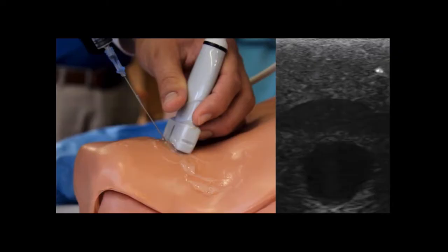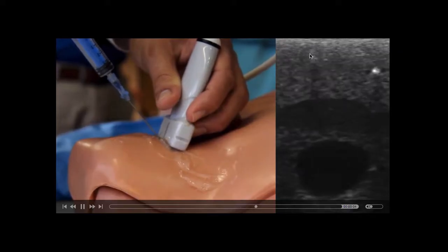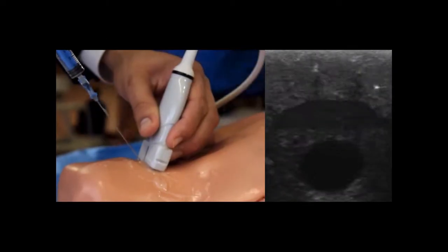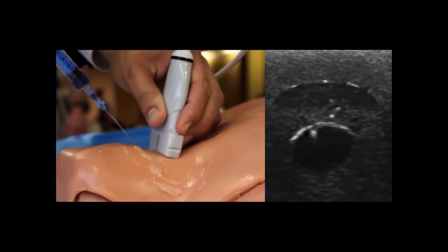Here's a good example of what not to do: I'm not moving my ultrasound transducer, keeping it steady, and the ultrasound beam only sees this little point here. I'm advancing the needle, but all I'm seeing is this point, and I don't know where my needle tip actually is. In this next example, I'm moving my ultrasound transducer with the needle tip, always making sure I keep it in my field of view until I get into the vessel and then aspirate.